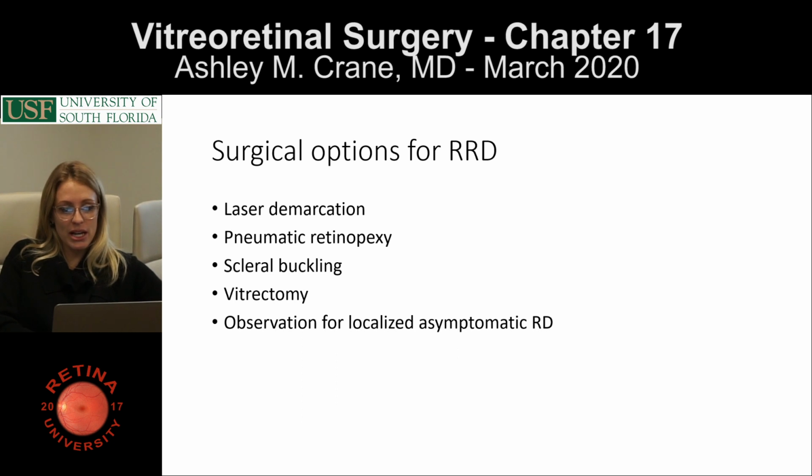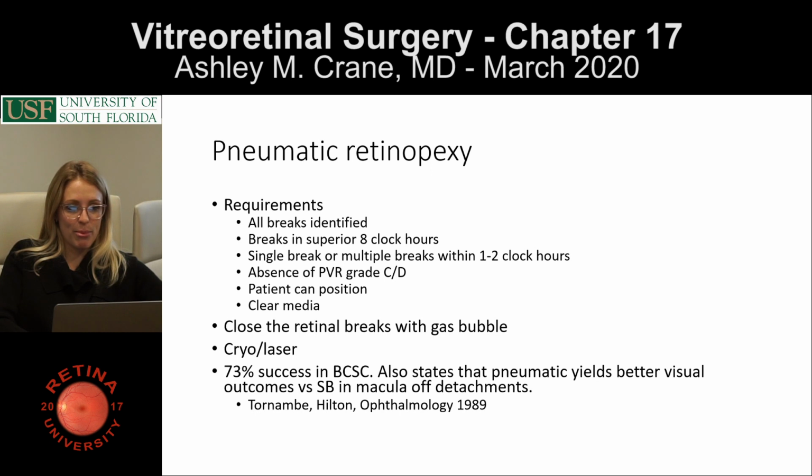And pneumatic retinopexy, and not just you residents, I've seen my own residents do that. Pneumatic retinopexy is an option for retinal detachments, as well as scleral buckling, vitrectomy plus or minus scleral buckle. So we'll talk about a couple of those. The requirements of pneumatic retinopexy probably are something that could be testable.